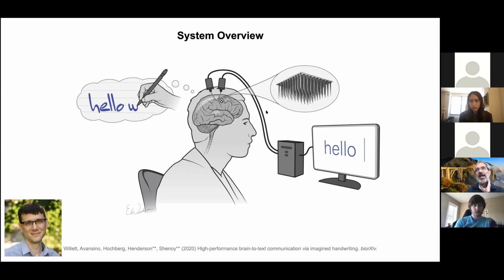okay? And then the goal, very importantly, I want to clarify, the goal is not to recreate this pen stroke, okay? That the H looks like this and the E looks like this. One could do that. That would be like pure motor decoding. Instead, we're interested in classification. We want to see if he can write this hello, because that's fast for him to think of doing, but classify as an H and then type just a standard H up on the screen, okay?